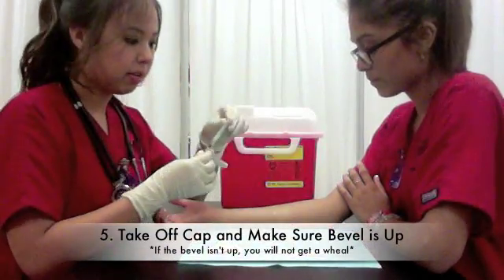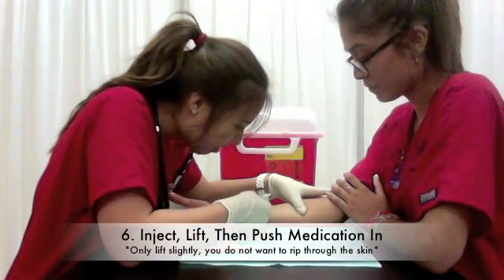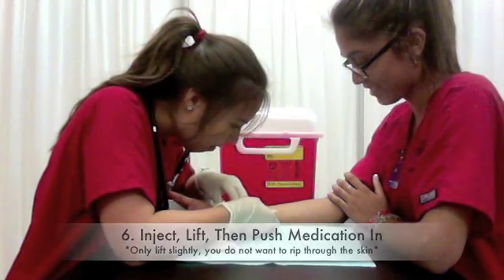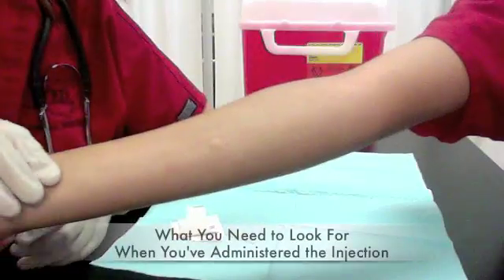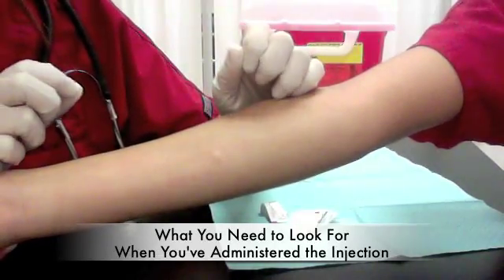Then you get your needle, make sure the bevel is up, you taut the skin, and inject, lift, and press. Then you cap your needle and face it down in the sharps container. When you do the injection, you need to make sure that you get a wheal just like this — it means you did the procedure correctly.